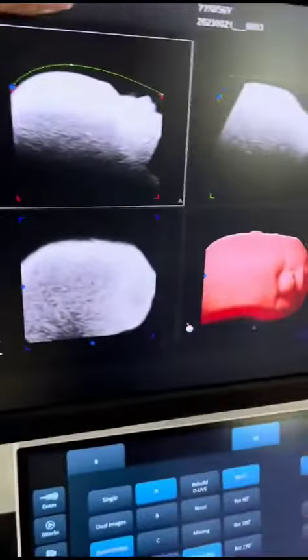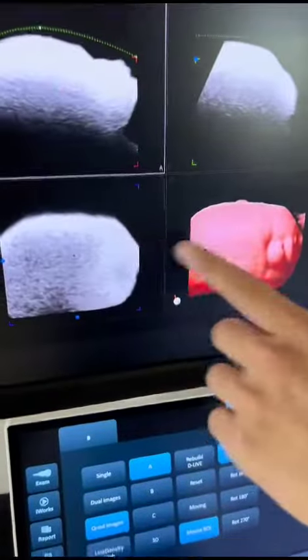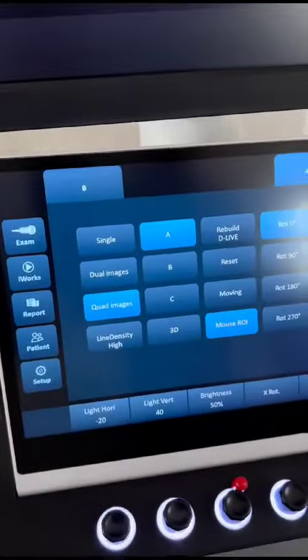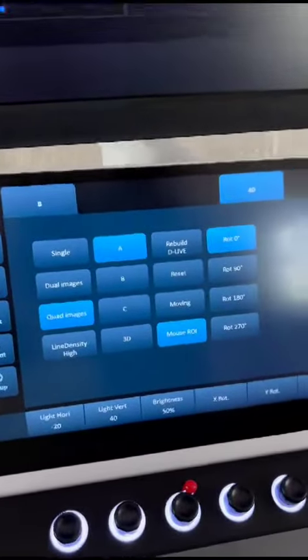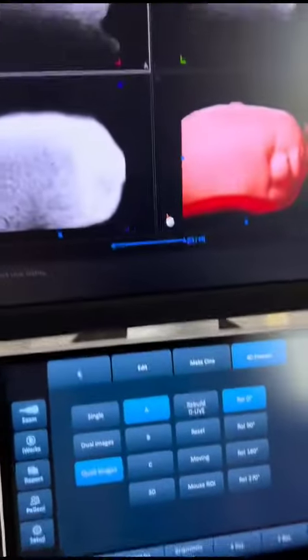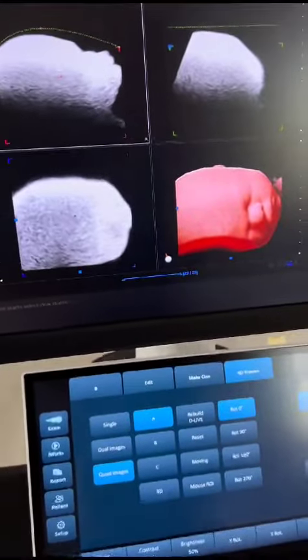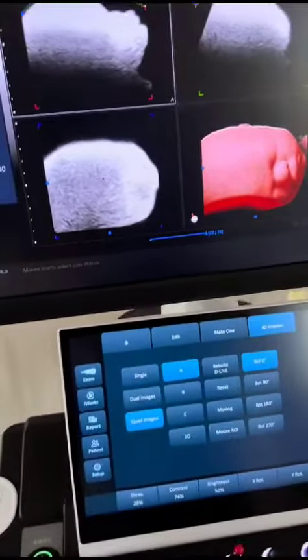This is the 4D image of this machine. Here we go.